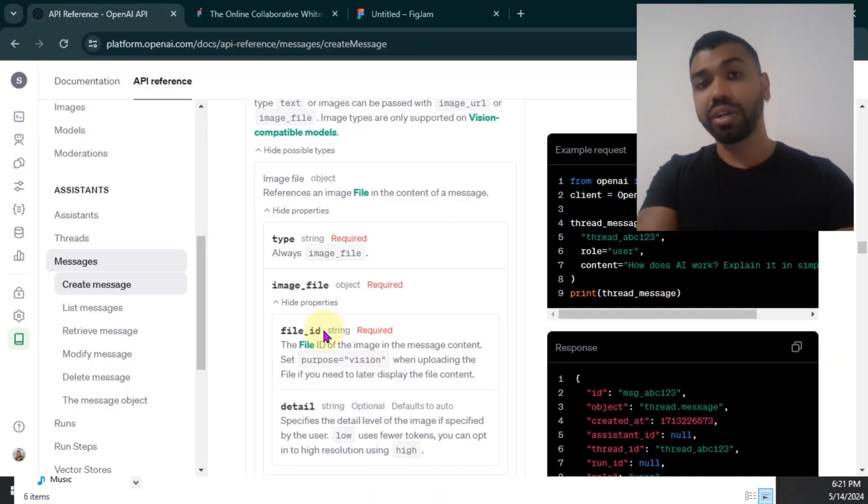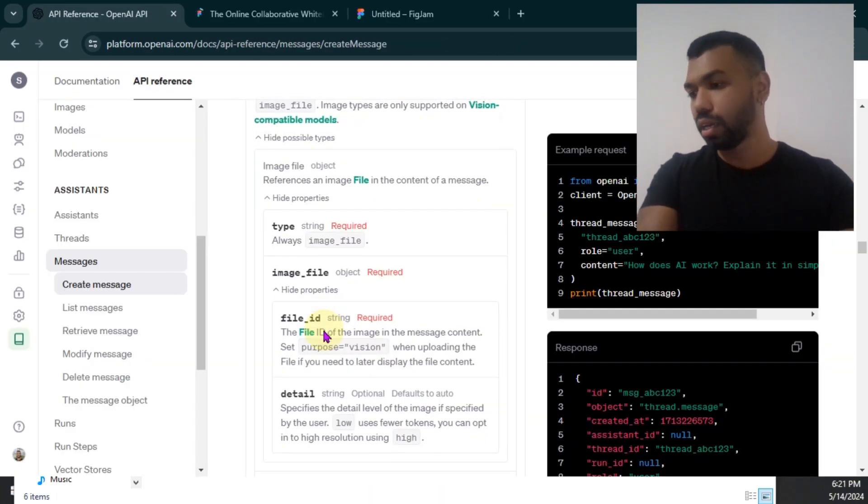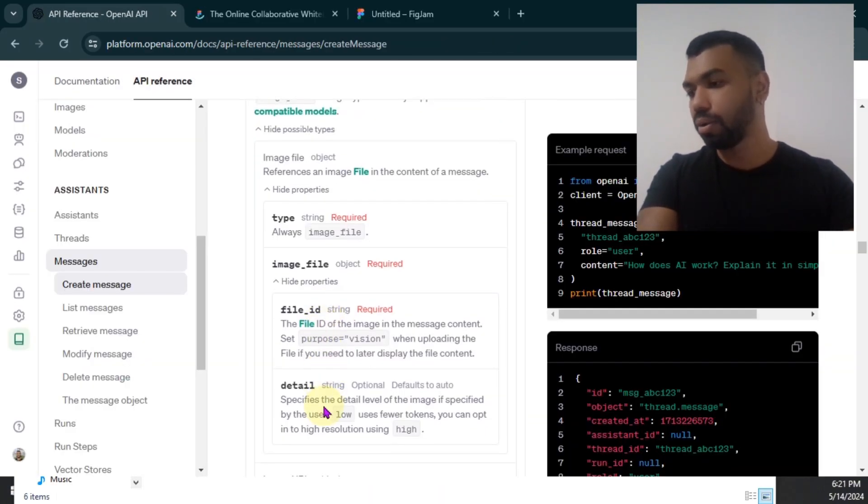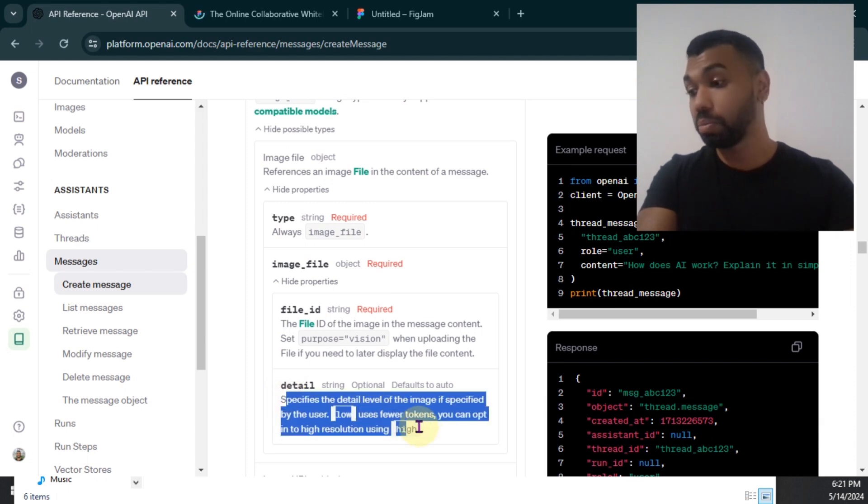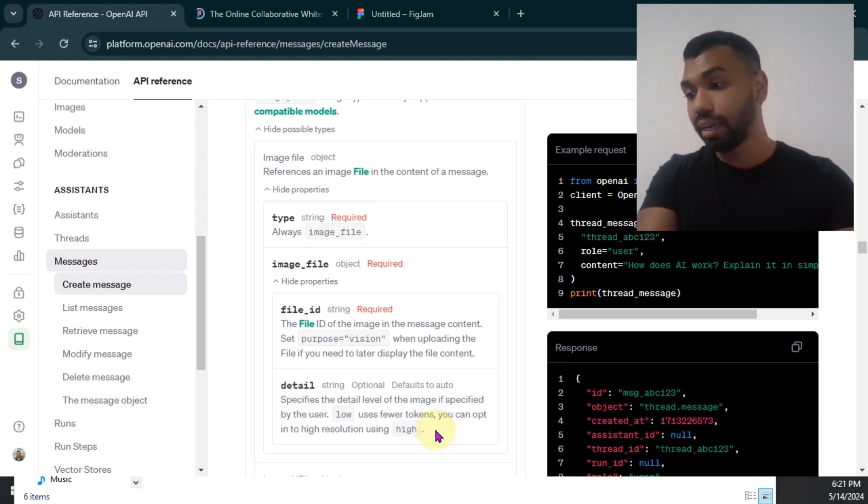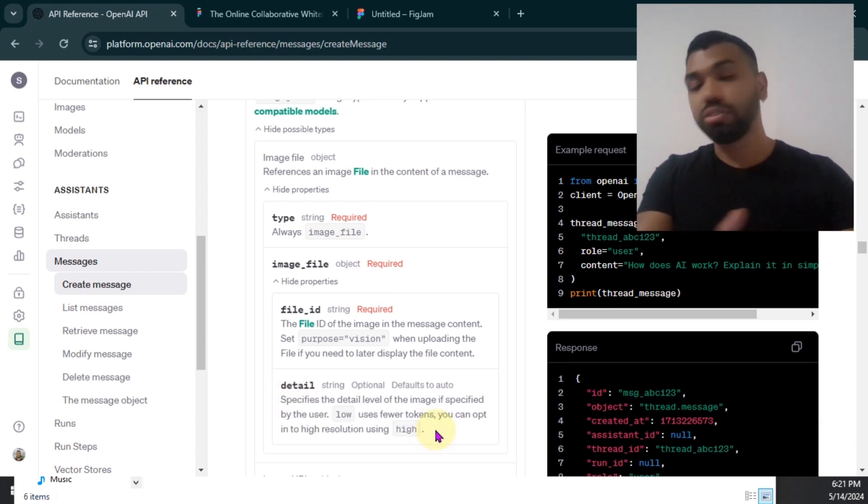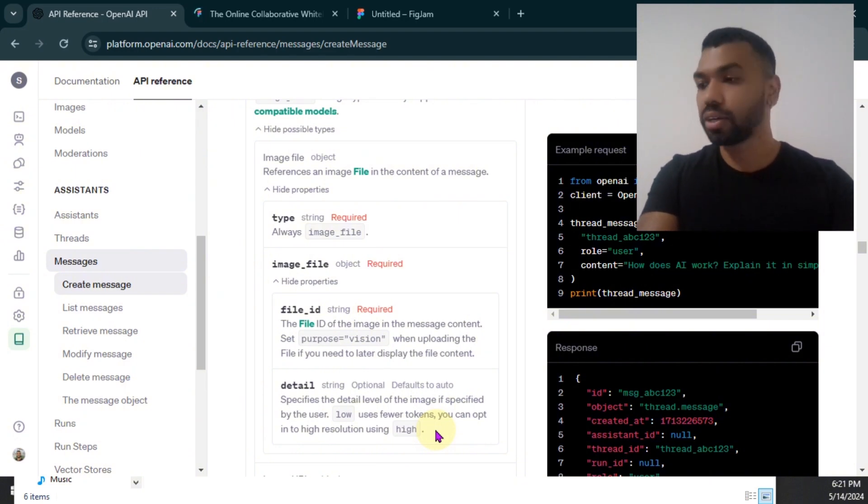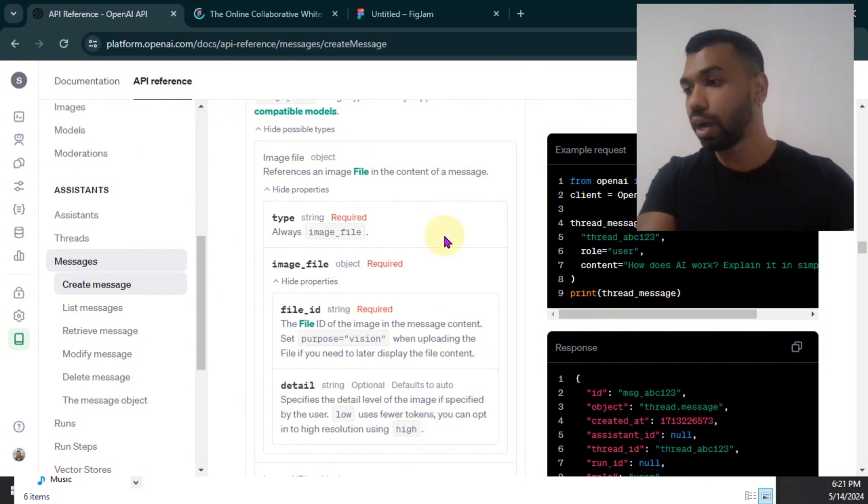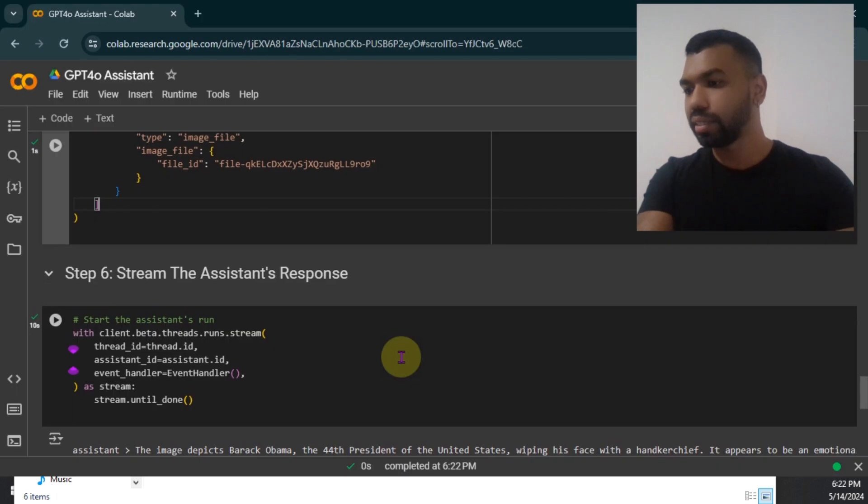I also want to point out when you're attaching the image file to the message, you can also specify the detail that you want to use. It could be low or high. By using low, you can use fewer tokens. And if you want to use a high resolution, you can use high tokens. So this is something you can take into consideration if you want to manage your cost. So this ran successfully.